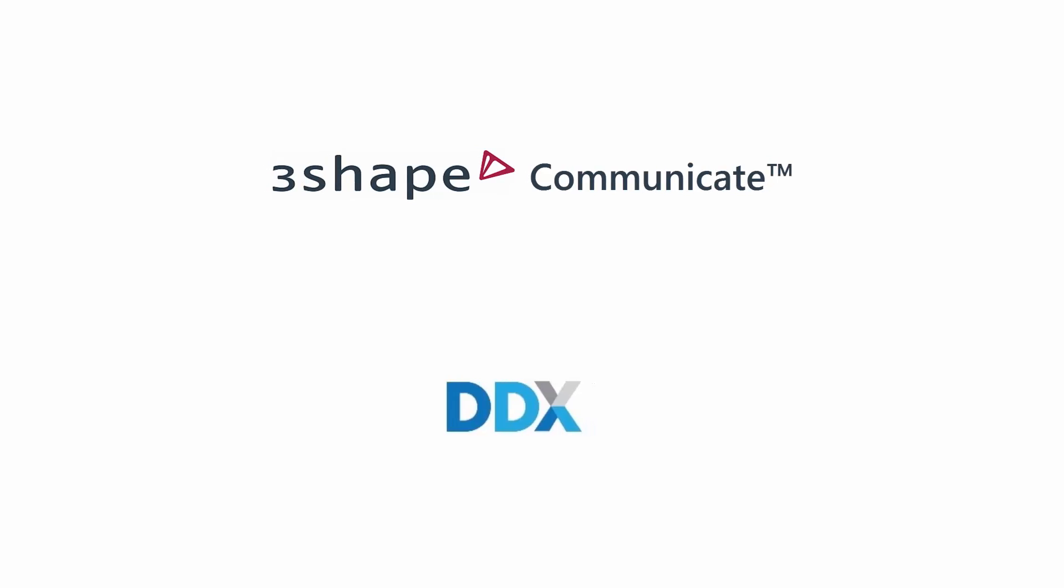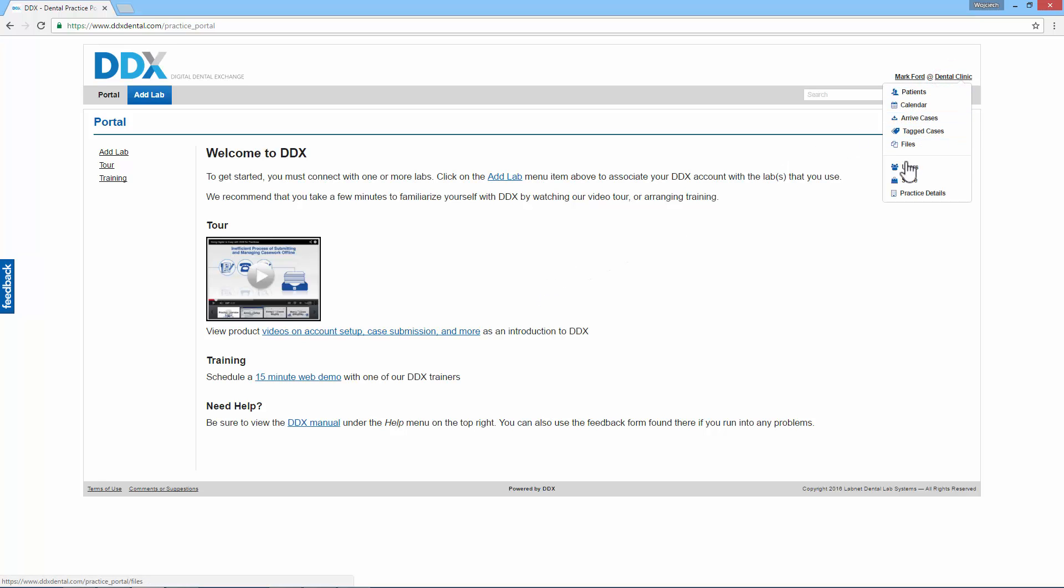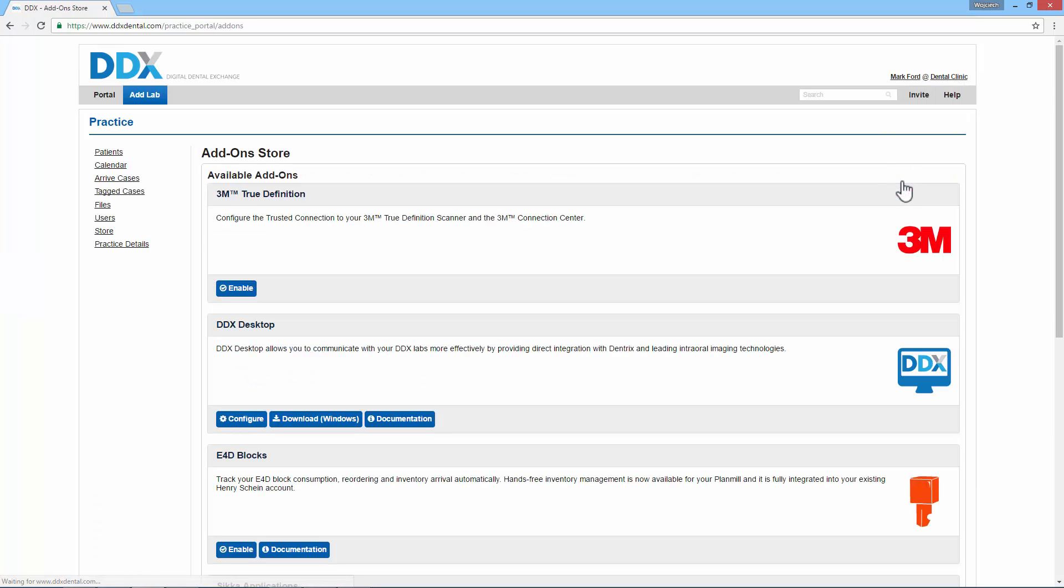The first step is to link the DDX and 3Shape Communicate account. Log in to your practice's DDX account. Click on the name of your practice in the top right corner. Select Store from the drop-down menu.